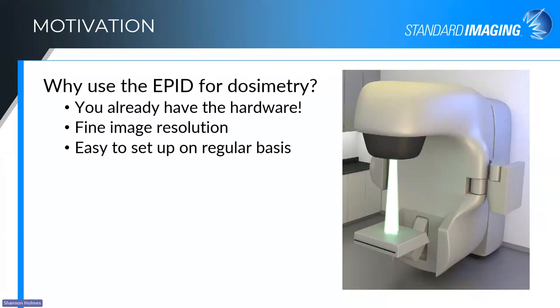So I was actually going to comment in kind of involved with your mention earlier about the EPIDs have improved. I think that's part of the reason that this wasn't used previously, is because the EPIDs weren't necessarily as stable. They weren't giving you the consistent response every time, or they would degrade more with dose, or it was just a different system that had more energy dependence, where it worked fine for imaging for your setup pictures, but it didn't necessarily work as we needed it to in order to get the dosimetry.